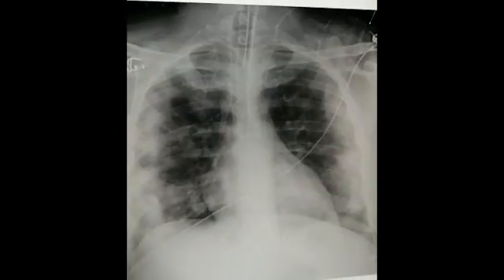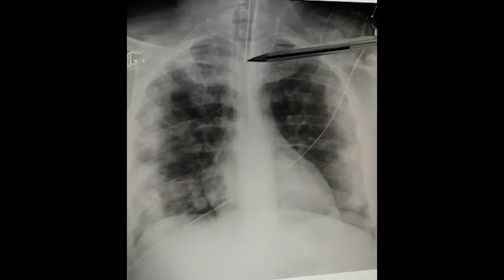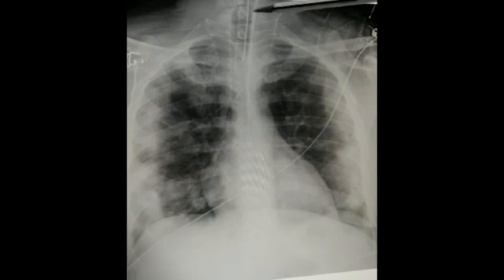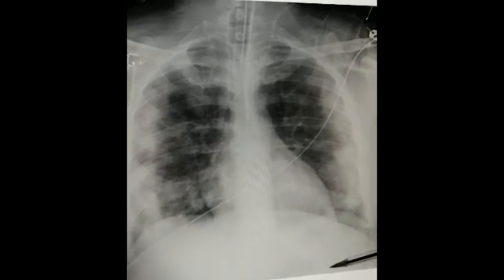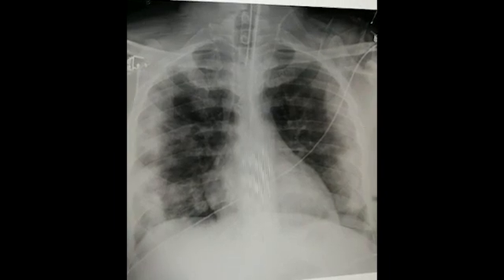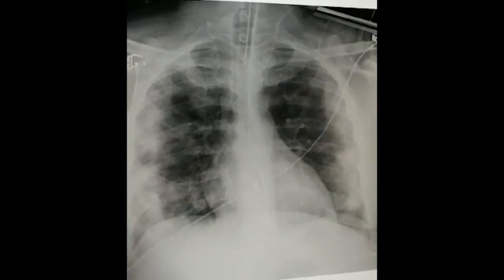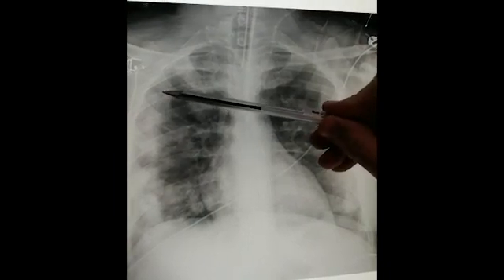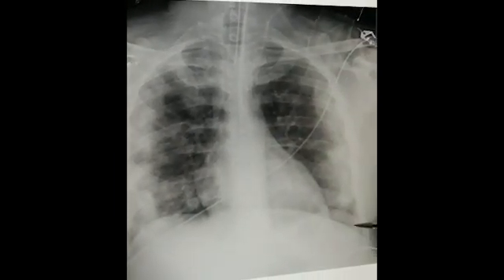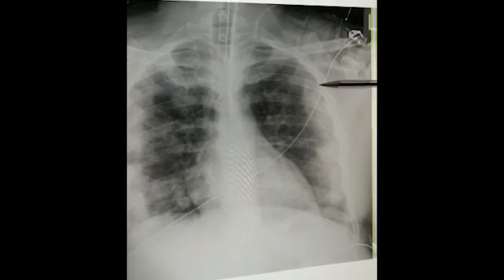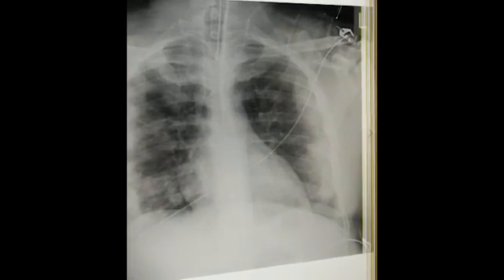Another case from ITU — again the lines are in place. ET tube in situ above the carina, NG tube in situ going down the midline below the left side of the diaphragm, and a central venous catheter in situ again via a left-sided approach. You've got those classic changes: peripheral patchy consolidation in the mid and lower zones, and also in this poor patient in the upper zone.